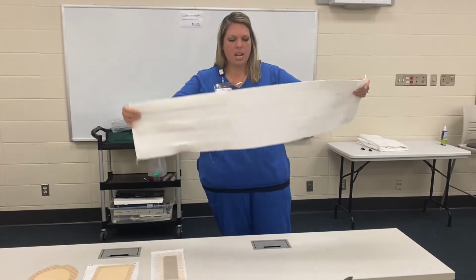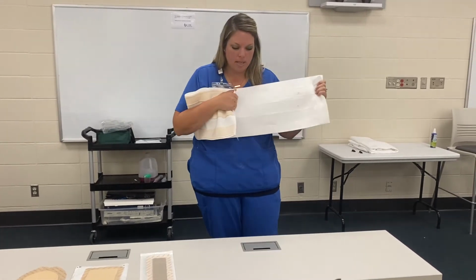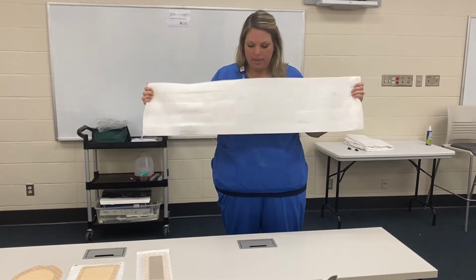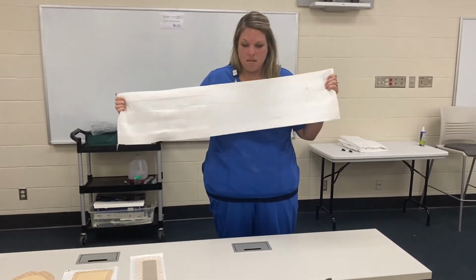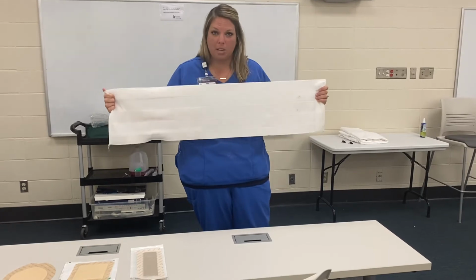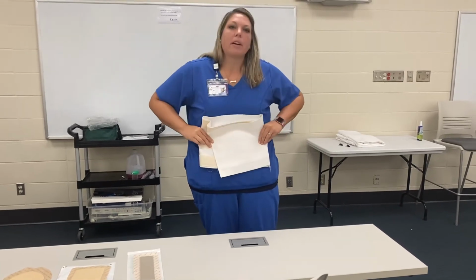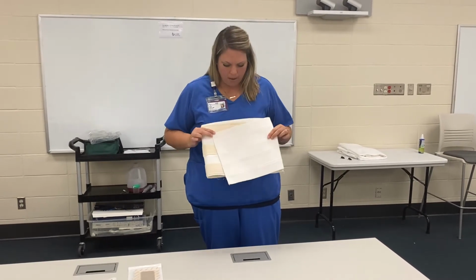So this first one is an abdominal binder. Today we talked about dehiscence, evisceration, and splinting. This is a device used for splinting, okay? If I have a patient that has an abdominal surgery, I can put this around them and wrap it tightly, and it sits around their waist and helps splint so we don't overexert those abdominal muscles, okay?